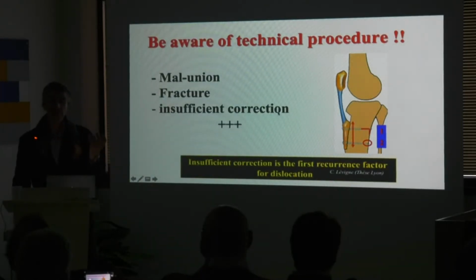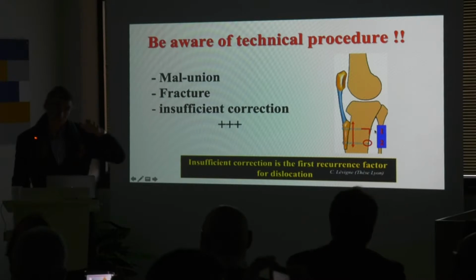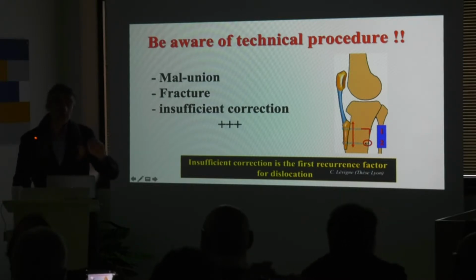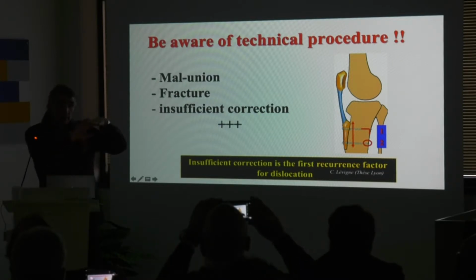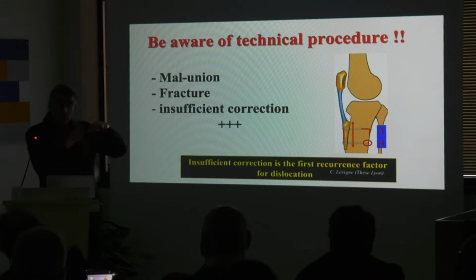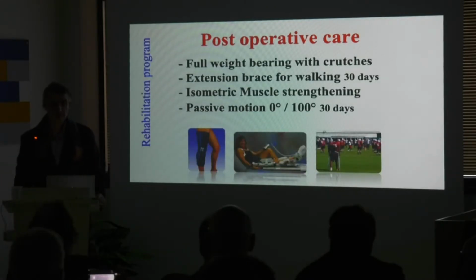Be aware of the technical procedure. On the X-ray, the screws should be bicortical to have some compression. And if your screws are not perpendicular but ascendant, you will lose your correction. So it's really stupid, but it's very important to have that.